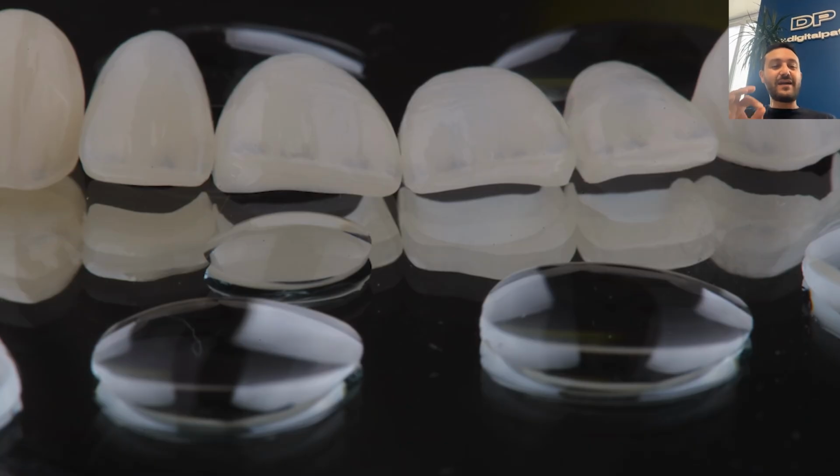These veneers are a result of well-planned and carefully executed team effort. Thanks to the digital patient, the technician has all the data needed to create a restoration that fits both the facial features and the patient's expectation. Every detail was planned in advance, from the prep thickness to the final margin line. Digital helps us be more precise. The technician's hand and eye still make the difference, and when the data is clear, the result speaks for itself.